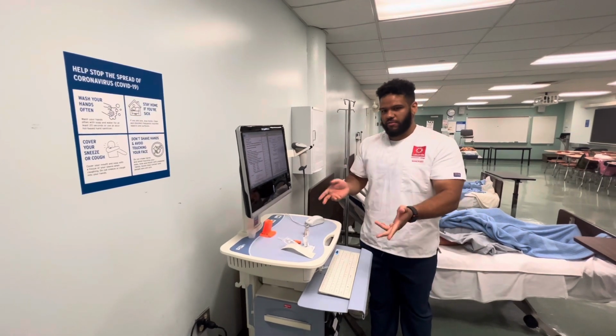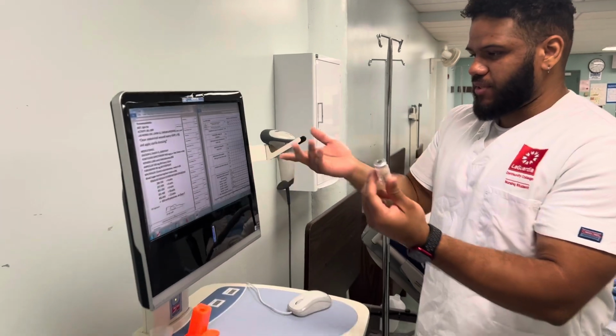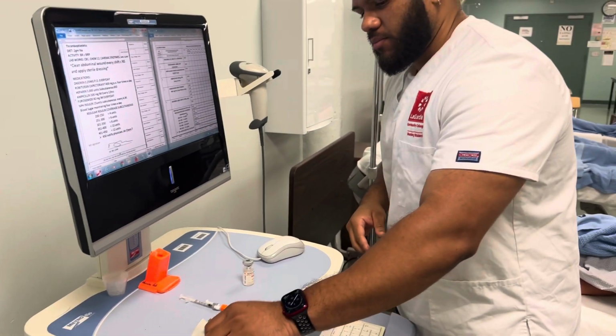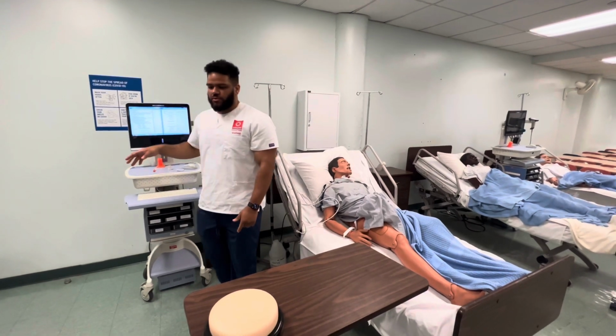Depends on you. I like to do it right here. So again, regular insulin. Our third check is done. And if we clean up, then we're ready to go to the bedside.